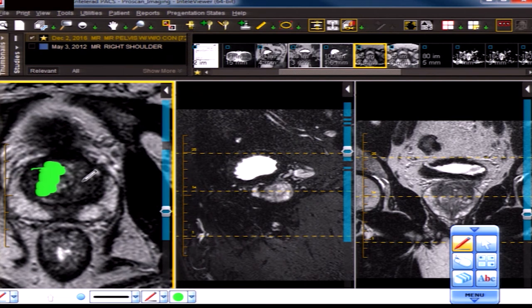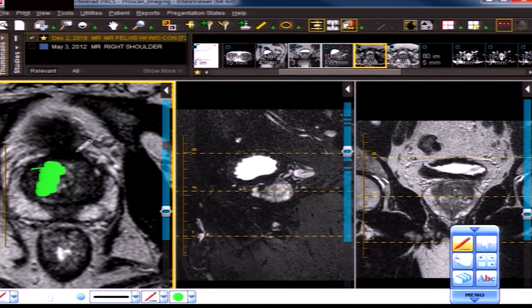Markedly hypo intense means almost black or no signal at all. There aren't too many things that give you that: pure fibrous tissue, calcium, fast flow, and the granddaddy — air — all give markedly hypo intense or signal-loss appearance. That concludes our discussion of the terms in the PI-RADS 2.0 lexicon. These were created by men and women just like you — they're guidelines, not set in stone — meant to help you produce a pattern recognizable to colleagues and urologic specialists for consistency in communication.